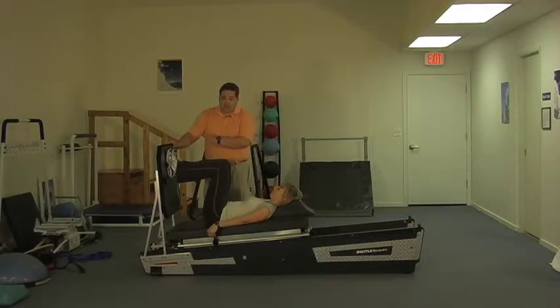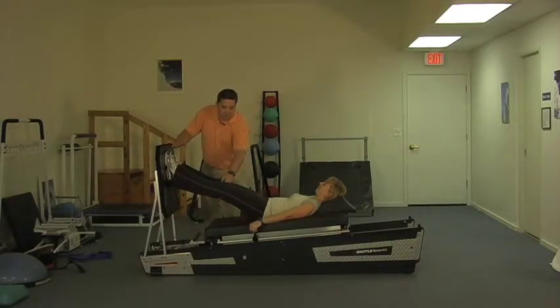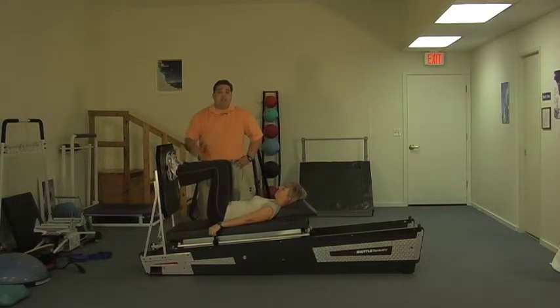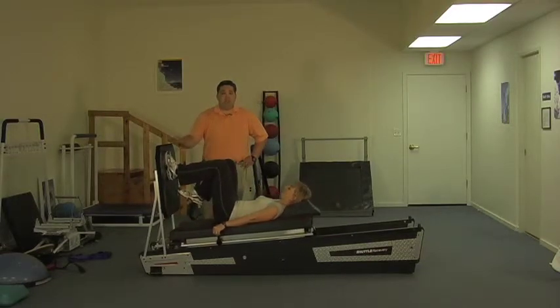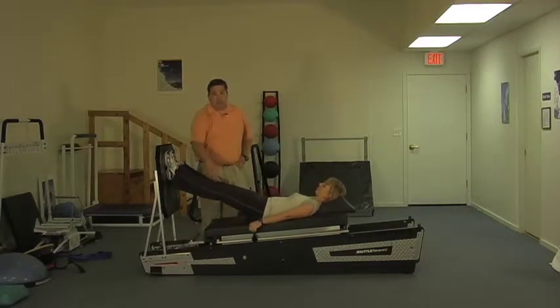With this setup you can control a lot of things — stabilize the core artificially and start things earlier to make sure they're biomechanically aligned. This has quite a bit of resistance. Go ahead and give us a standard double-leg squat up. That's a lot of load, but with eccentrics you're trying to overload things. The protocol is two legs up, one leg down: on the down stroke, only use one leg to work. Two legs up is the concentric phase; one leg down is the eccentric. This essentially stimulates and improves the histology of that patellar tendon.